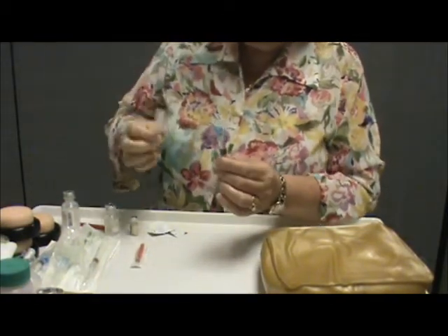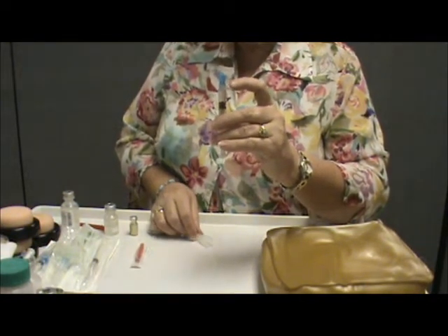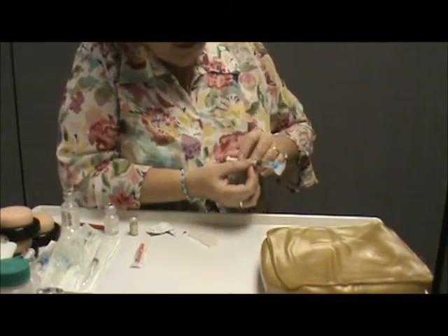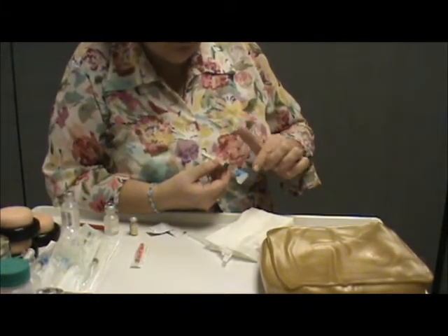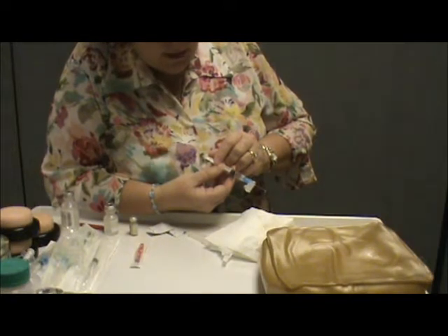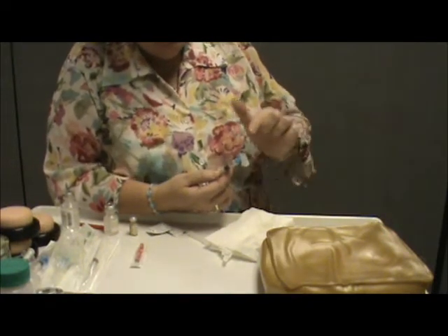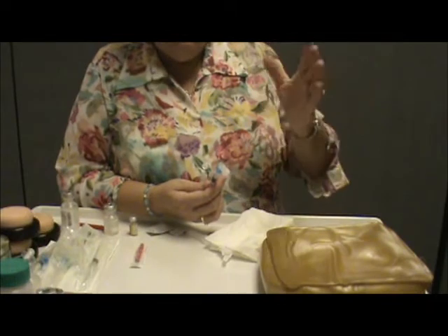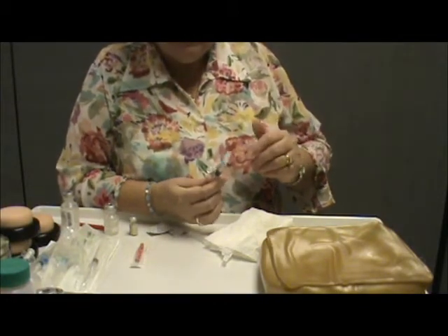Alright, so I have no air in my syringe, but I have fluid, I have air in my hub, and what I need to do is, with the bevel down, inject that last milliliter, and I want my hub to be filled with fluid all the way out to the tip of my needle. So I'm holding it horizontally, and once I get out there, I'll click it to tap it and make it drop off, because you don't want it to be coming back down the length of your needle, because if you have a very irritating medication, then you're going to have your needle contaminated with that, and it's going to be a more painful injection.